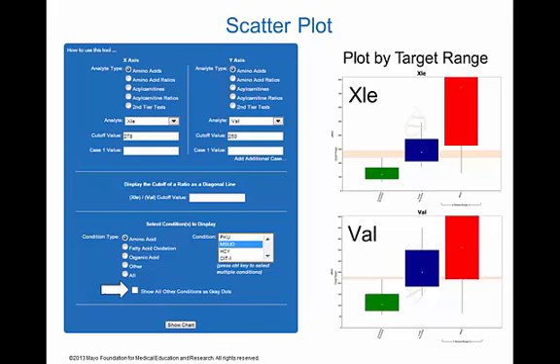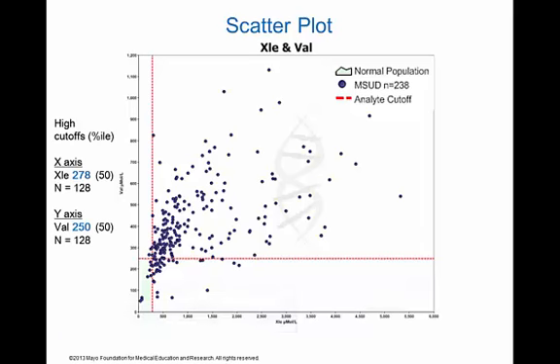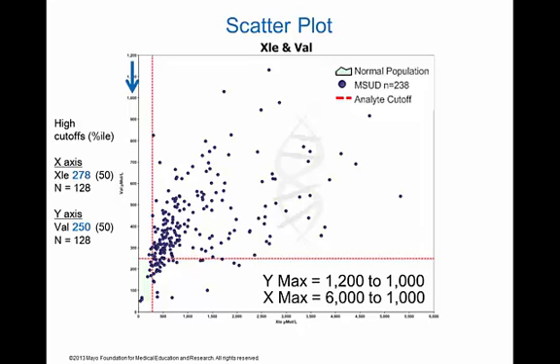When Show Chart is selected, the following image is displayed. The pair of results for each case with MSUD is shown as a blue dot. The scale is automatically set to 20% more of the highest value on record, so the reference limits are compressed at the bottom left corner of the plot. This is easily changed by clicking the mouse once within the plot to reformat the 2 axes. To continue this presentation, both axes are reset to a value of approximately 1000.